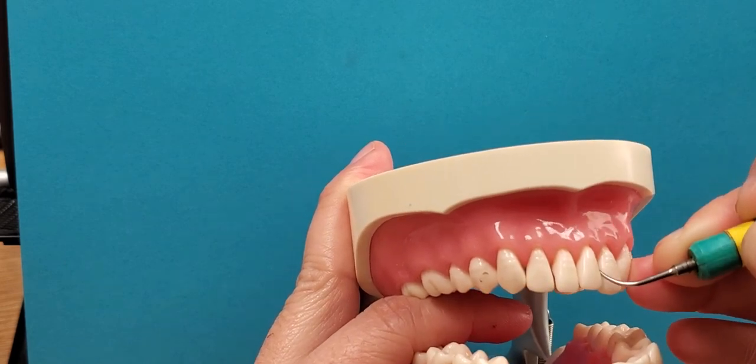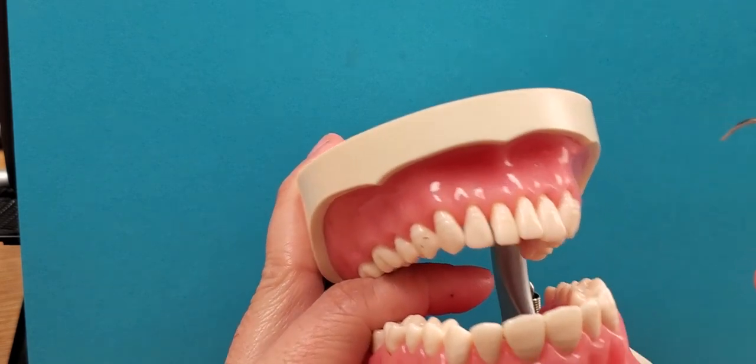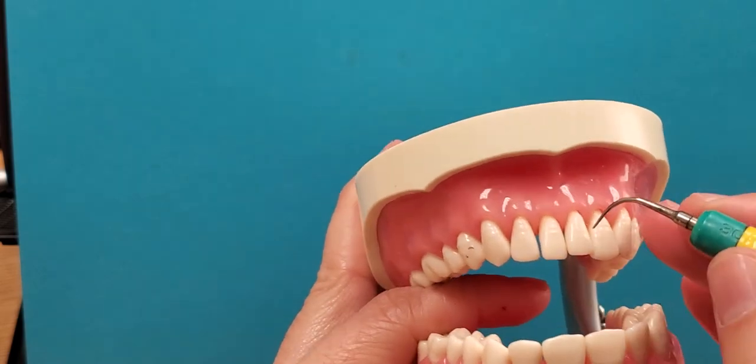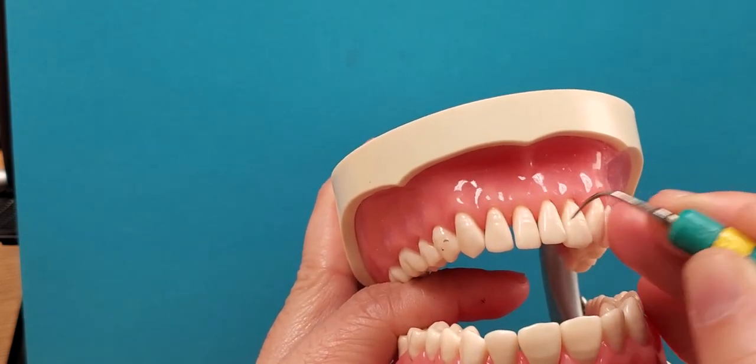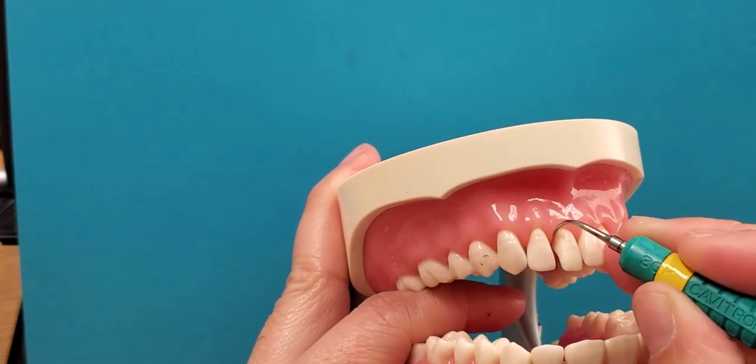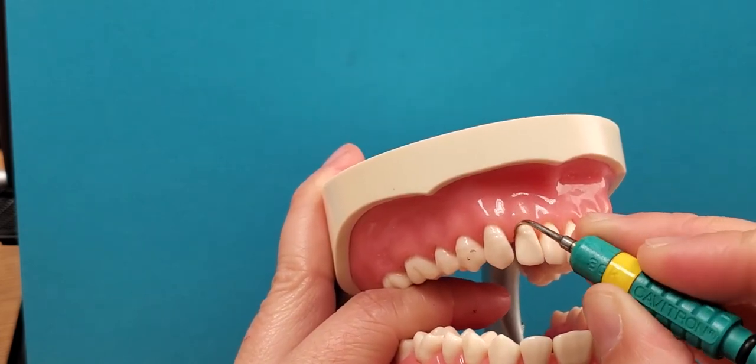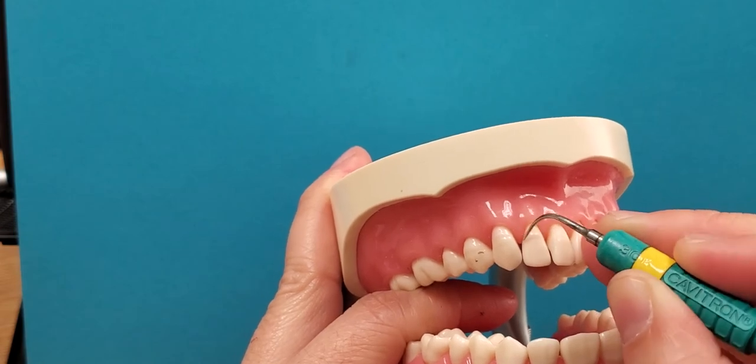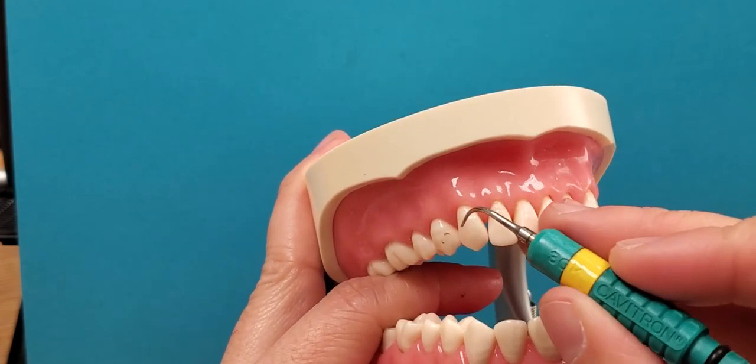And then once you're finished with probe style in that sextant, then come back and do your curette instrumentation in places that you might need to remove calculus up underneath the contact and on the line angles, very helpful for those places.